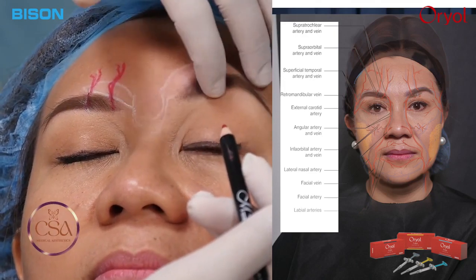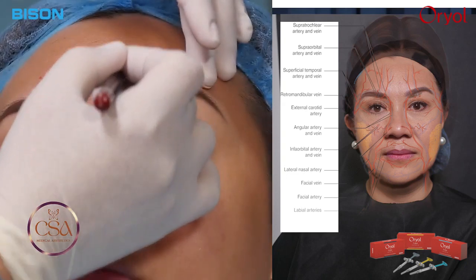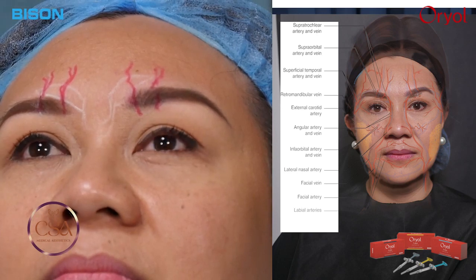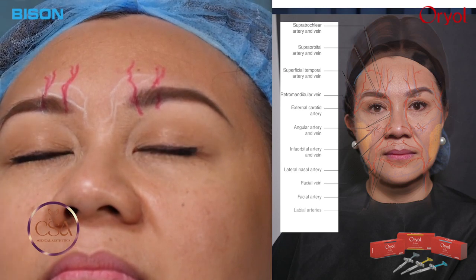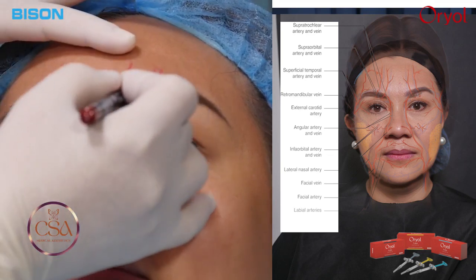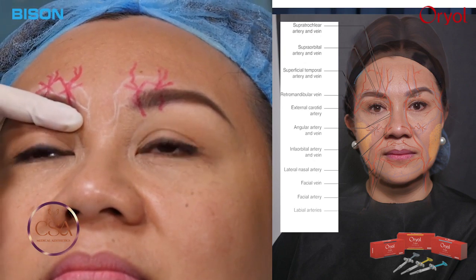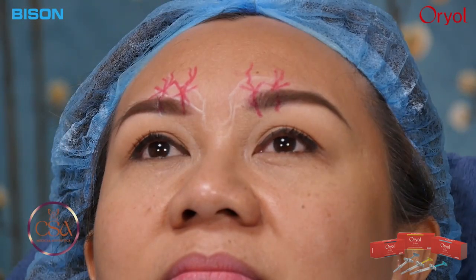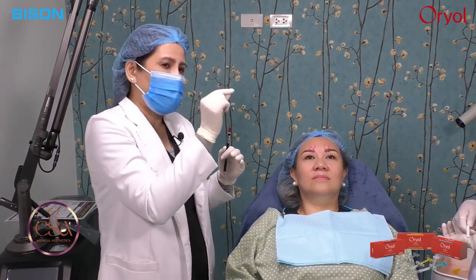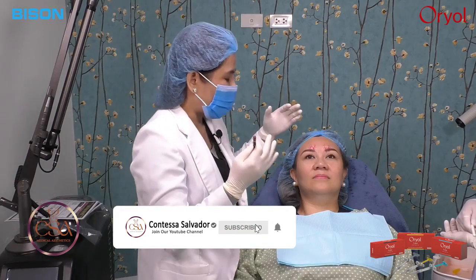So for our doctors performing this, you have to do your marking of the supraorbital and supratrochlear vessels. These vessels are branches of your internal carotid artery, and they connect with the ophthalmic artery. They connect with the artery in the eye. Okay, so these are danger zones, no-go zones for filler injections, okay? Now, of course, we doctors know the anatomical tissue layers, and the layer where these vessels are located is the deepest layer from the bone. So when we do filler injection, we go at the superficial layer, in the deep dermis or the subcutaneous layer. We call it layer 2. Okay, so we have to stay in the right anatomical layer.